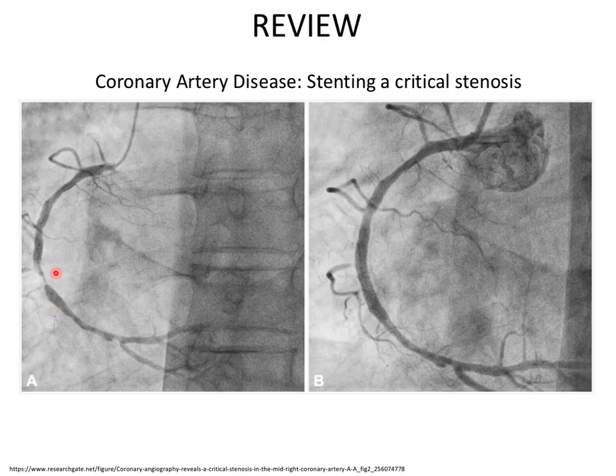So they go after this one, and then it looks like this post-stent implantation. It's much wider, right? You can see the lumen itself is probably the widest of any of the remaining lumens. You can see the shadow of the stent from about here to here along there. But it sure looks better, right? It's hard not to want this done. If this is your coronary and you have bad chest pain, I'll take this any day, right? It just seems sensible.